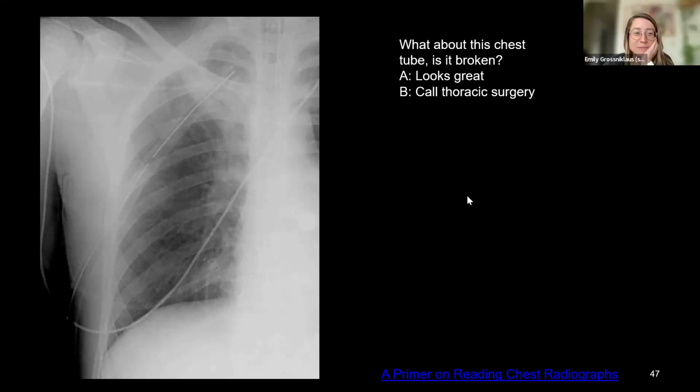This is a good one. Okay. All right. 44% said it looks great, and 56% said call thoracic surgery.